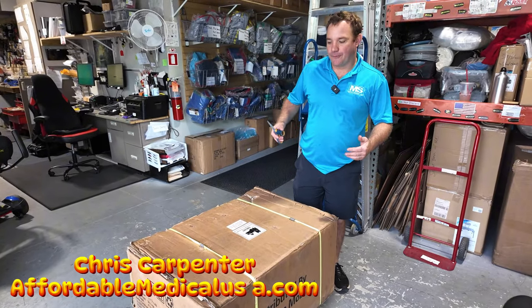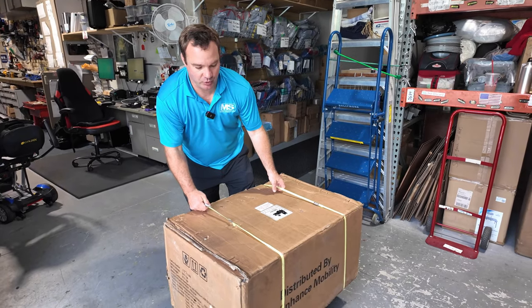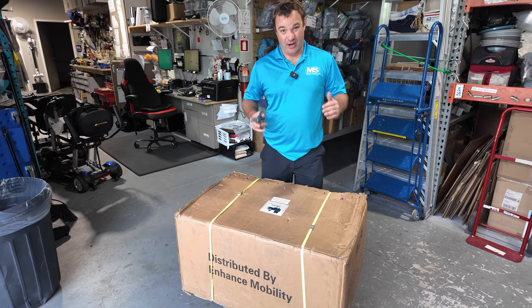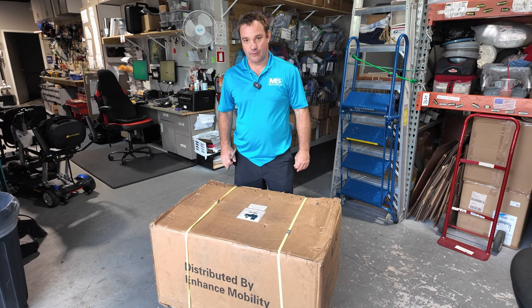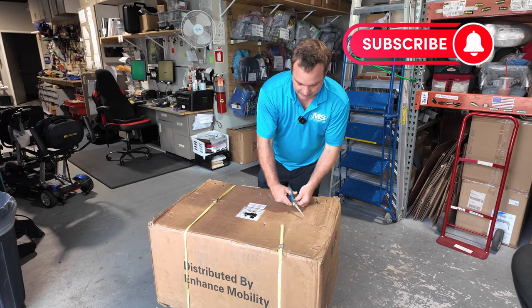Hey, I'm Chris with Mobility Solutions, affordablemedicalusa.com, and this is a new unboxing 2024 of the Triax Sport by Enhanced Mobility. This is a recreational scooter, so this scooter is not for everybody, but this is a really cool scooter. We've sold a lot of these over the years, and they just came back, and we're going to show you how to unbox it.